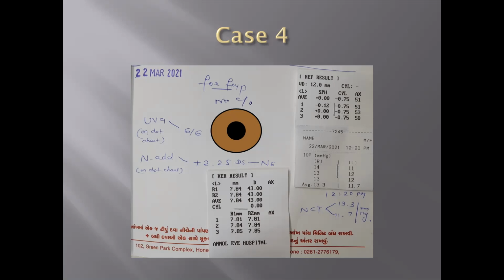So everything is fine. You put all this together, and if you finally decide that everything is fine, then go ahead with the final refraction. That should be around 1 month after surgery, not before that, because intraocular pressure can be variable with the use of steroid and non-steroidal anti-inflammatory drugs. Even the healing of corneal incisions may change the refractive error over a period of time.